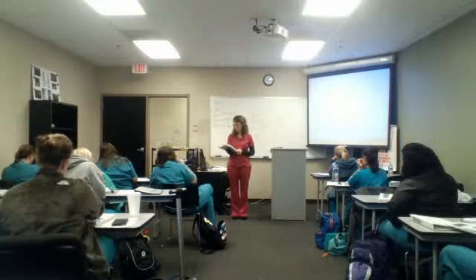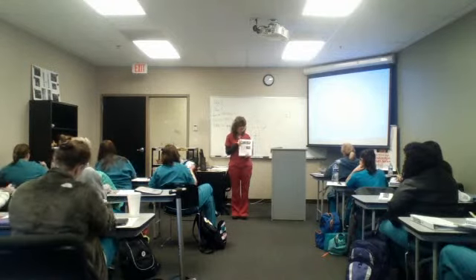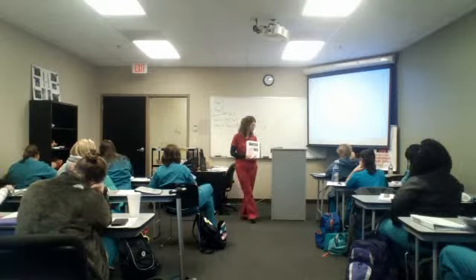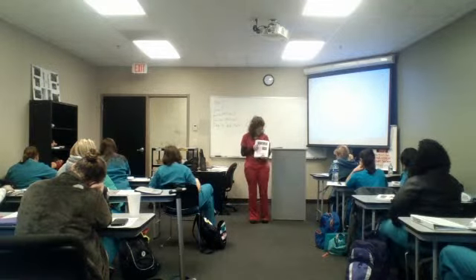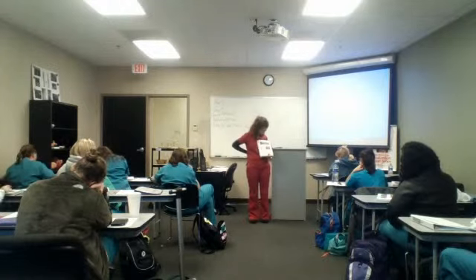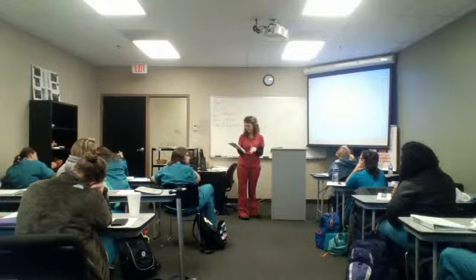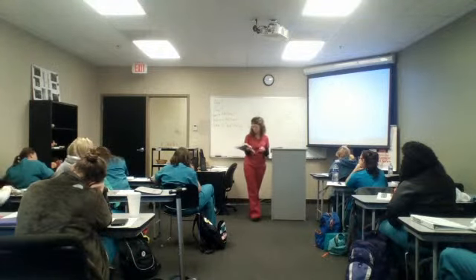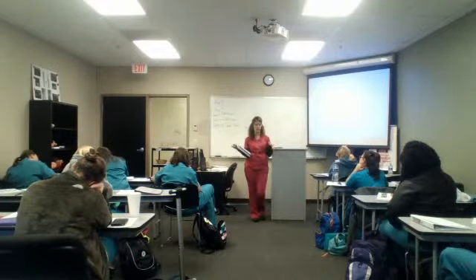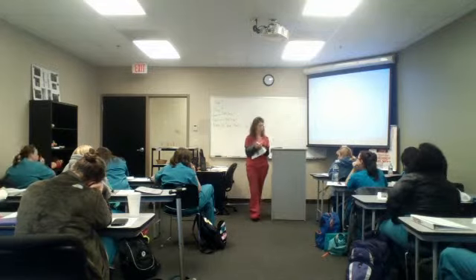The very first picture is showing the popliteal vein lengthened out and long, and you can see the gastroc draining into it. Okay? So there's just a little example of how you can see it. The second picture is transverse of the gastroc and the soleals. But then it says in this paragraph that soleal veins drain to the posterior tibial and the peroneal. It's not routinely that we scan these, okay? Most of the time you're just going to do anterior, posterior, and peroneal and be done.